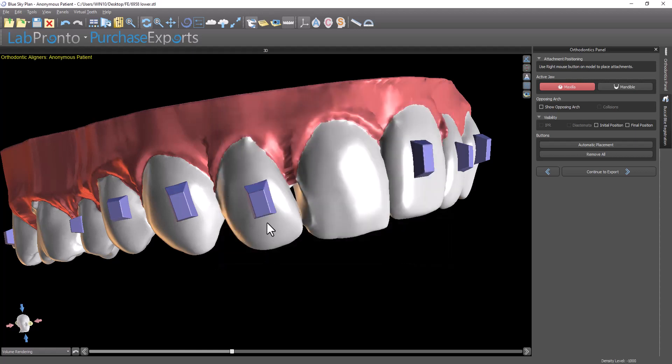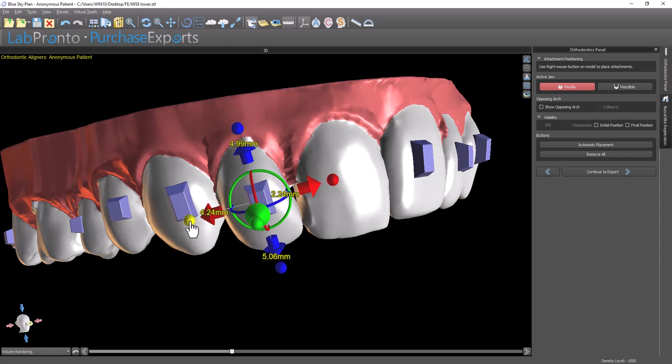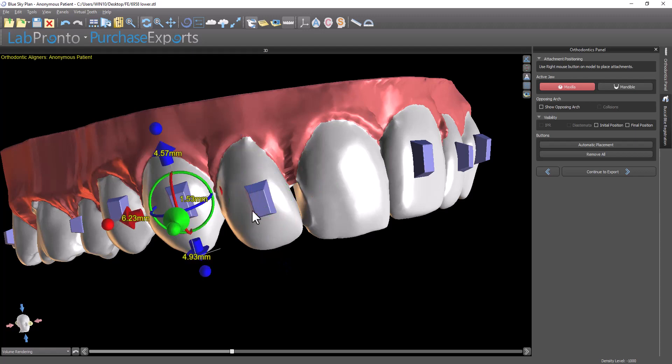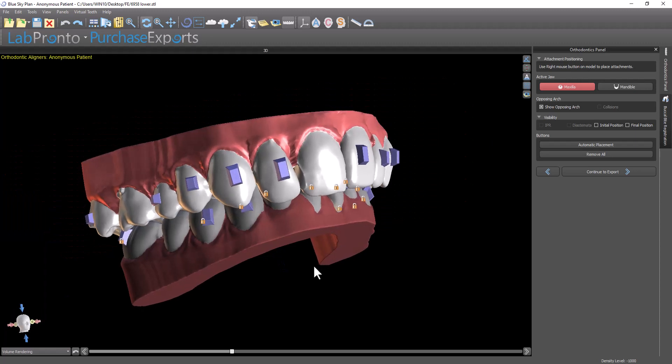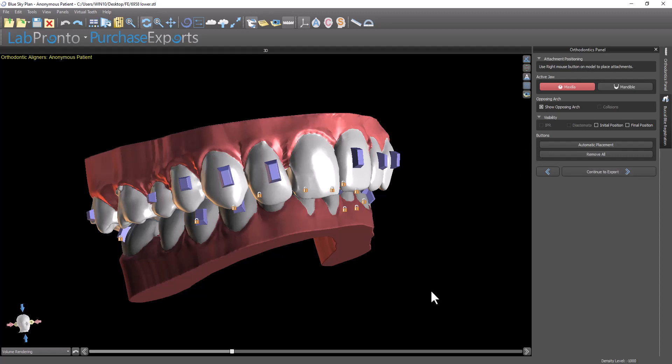Mouse over and the widget comes up. Use any of the widget's functionalities to resize, rotate, and move the button that was just placed or any other button. Once you're happy with the button placement and you've confirmed it, simply click continue and the software will take you to the next step based on your selection with the radio buttons.